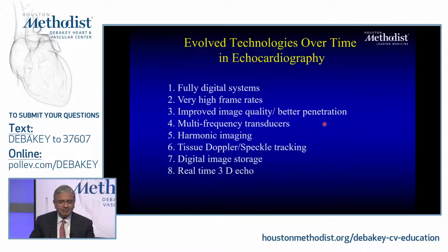Things have improved from a processing point of view. Image quality is certainly much better nowadays. In the past, if you wanted to use a high frequency transducer, let's say of 5 megahertz, to have a better resolution of what you're looking at versus a 3.5 megahertz transducer, you had to change transducers. Nowadays, you could just dial in a change of that multi-frequency transducer.